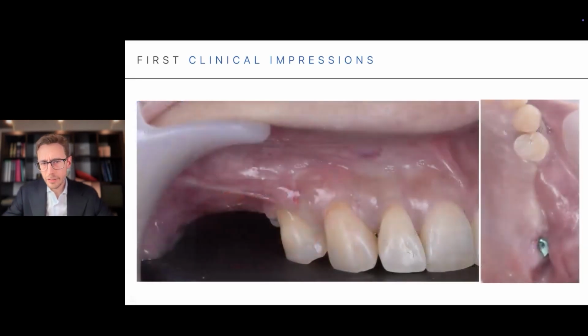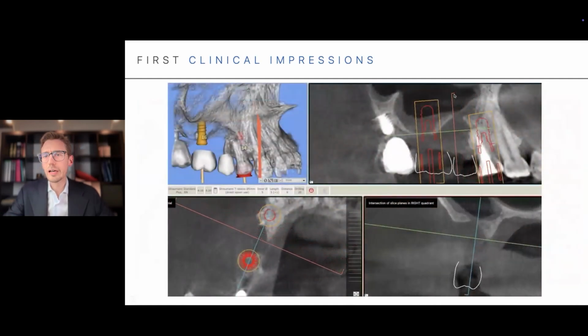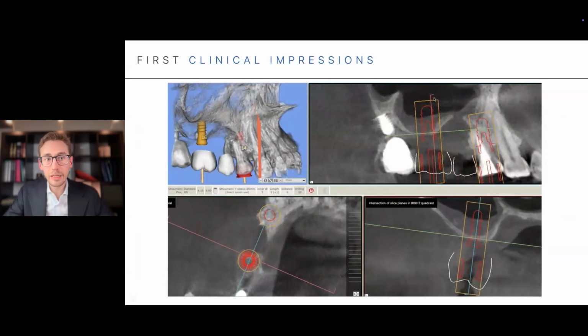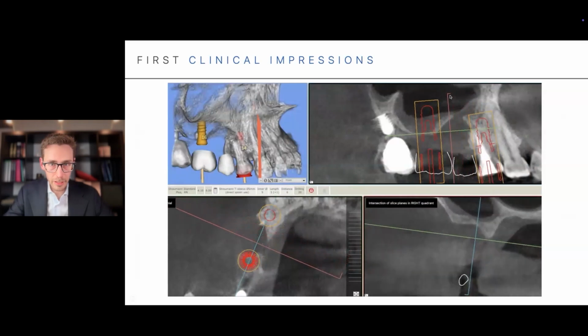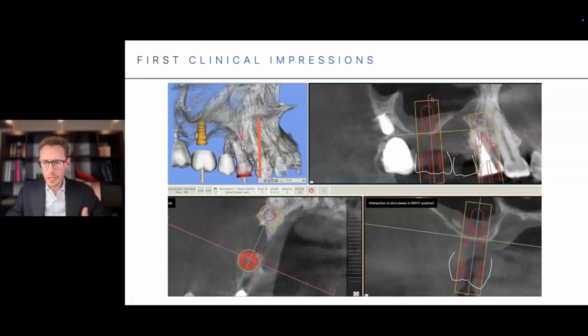And as you can see, it's a case of previous multiple implant failure, where due to a peri-implantitis at site number 15, the implant was extracted and an oroantral fistula developed, which was closed with multiple attempts of rotational flaps, the last one of which was performed with a Bichat fat pad flap. We still have a residual tooth number 14 with a hopeless endoperiodontal lesion. The tooth has already been treated with an apicoectomy, but still has symptoms and a residual pocket. And at the same time, we have a residual peri-implantitis on implant number 17. So you see, it's a challenging scenario.